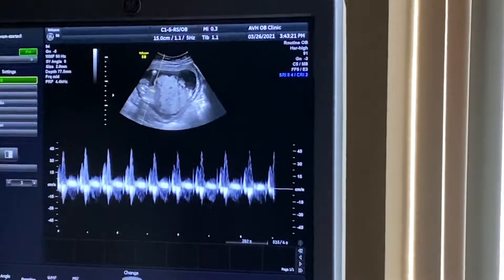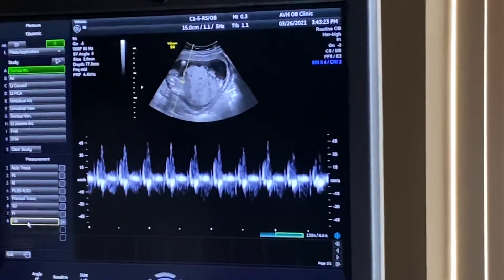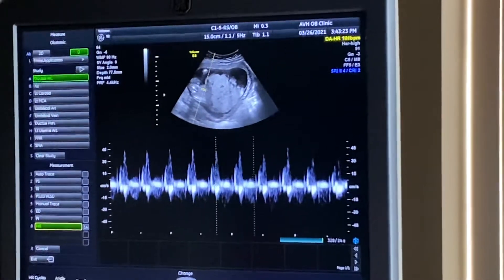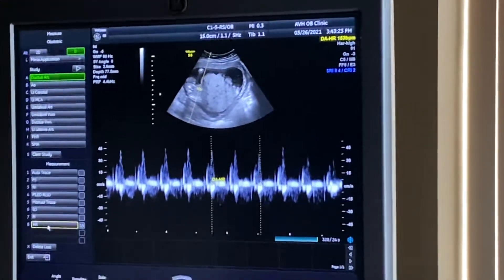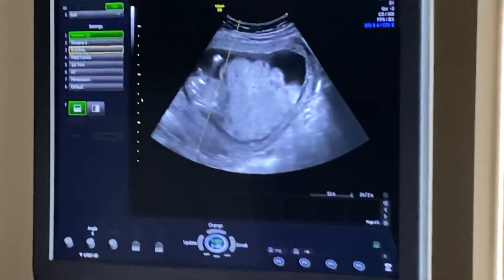What's that? That's the baby's heartbeat. We're going to just measure that. Right at 153 beats per minute.